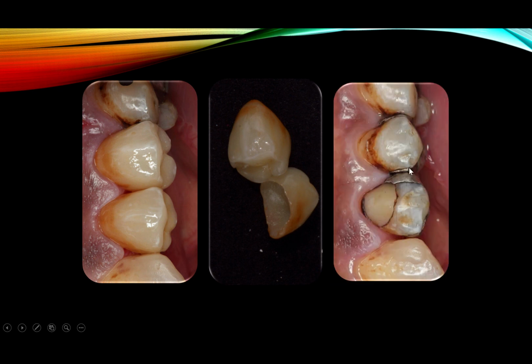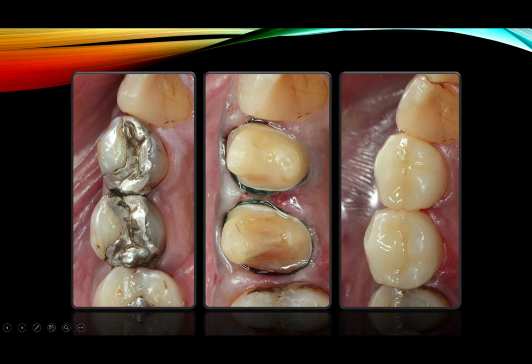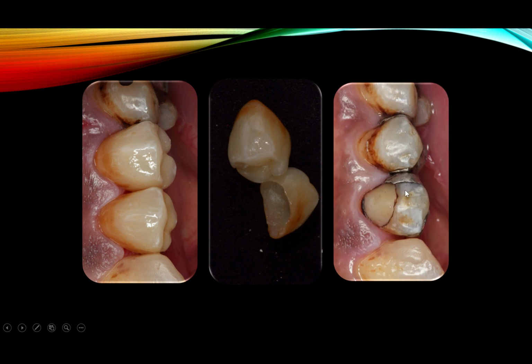Now, my question would be, why would you do two premolars here? Why would you do these in anything but monolithic? They're not in the anterior zone, or say that they are right behind, first premolar and second premolar. But there isn't much that you can do for the patient for layering to give them something better than this, especially that there are cavities here and there is amalgam as you saw and all kind of stuff, and this blends in, and there's breakages and all kind of stuff in his teeth. So why wouldn't we give him the strongest monolithic that we have and still matches the surrounding dentition?